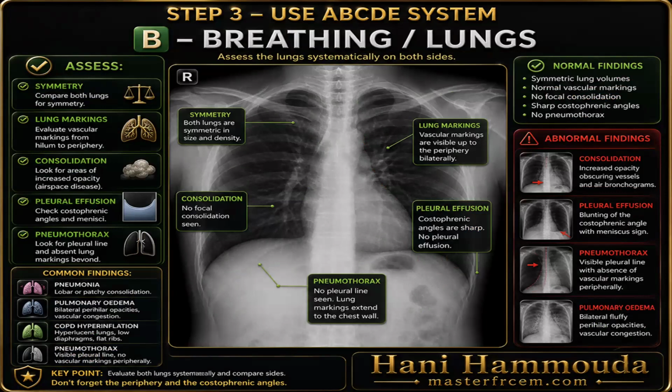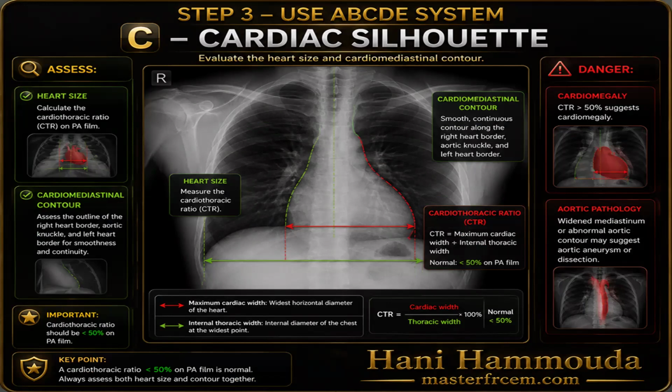Easy? C, you will comment on circulation. It means heart and aorta, right? Heart is relevant to circulation, aorta is relevant to circulation. I wish it's clear.